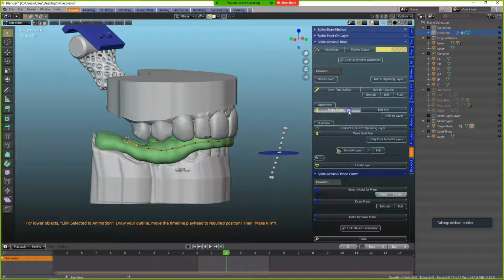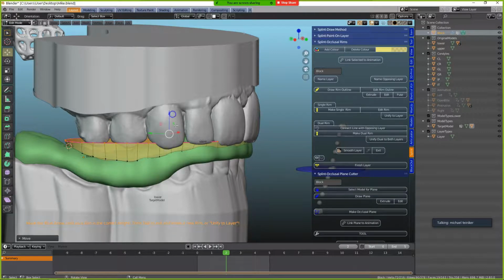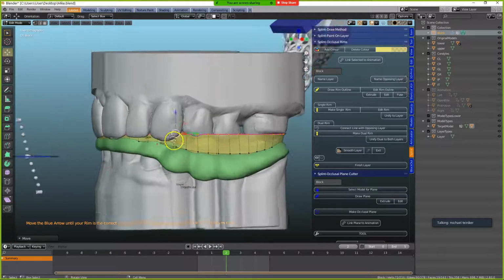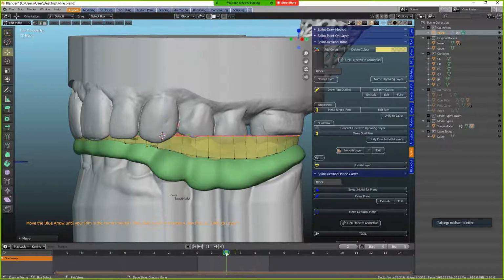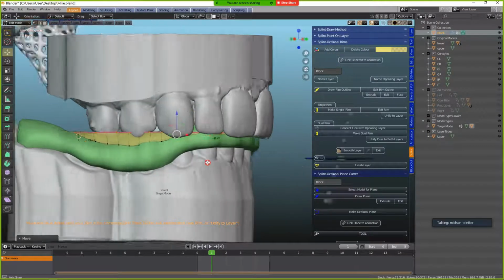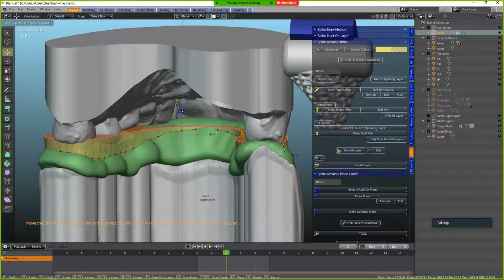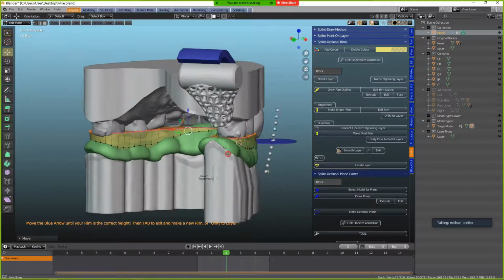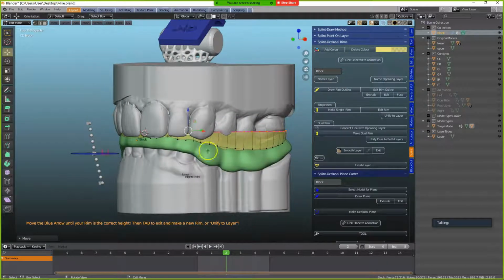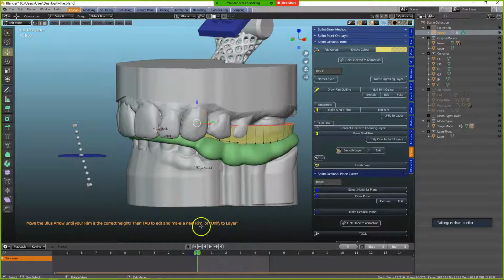Okay, I'm going to click on make single rim, and now it's extruded downwards. I'm going to just pull it upwards. Okay, and we're going to make it number 1 or number 2, adding a little bit of material. So we're not adding much. Maybe up like that. We don't want to intersect it because we're going to be intersecting there. So I'm going to pull it up a little bit just to make sure it's not intersecting there. And the teeth look quite deep as well, but once we move it out, it should be okay.